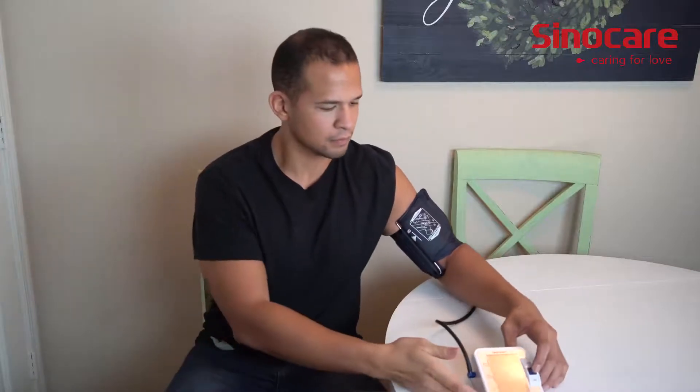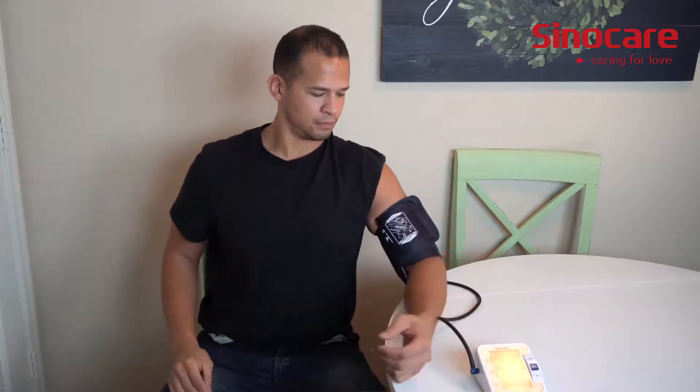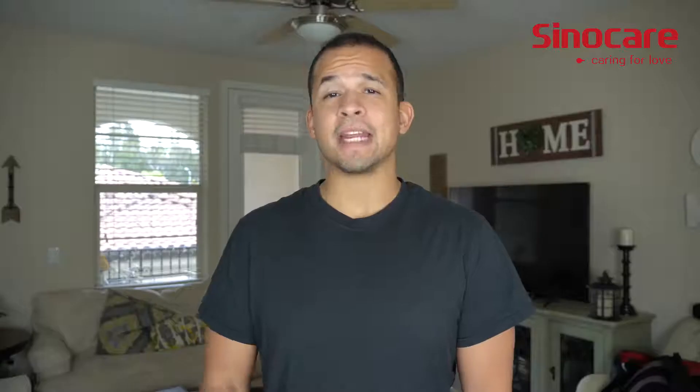Just a few other things that make this bad boy super awesome: it has an arrhythmia detection function, two times 90 sets memory, one button touch measuring, and a power off function. That arrhythmia reminder function is really, really big to highlight because that could save a life.